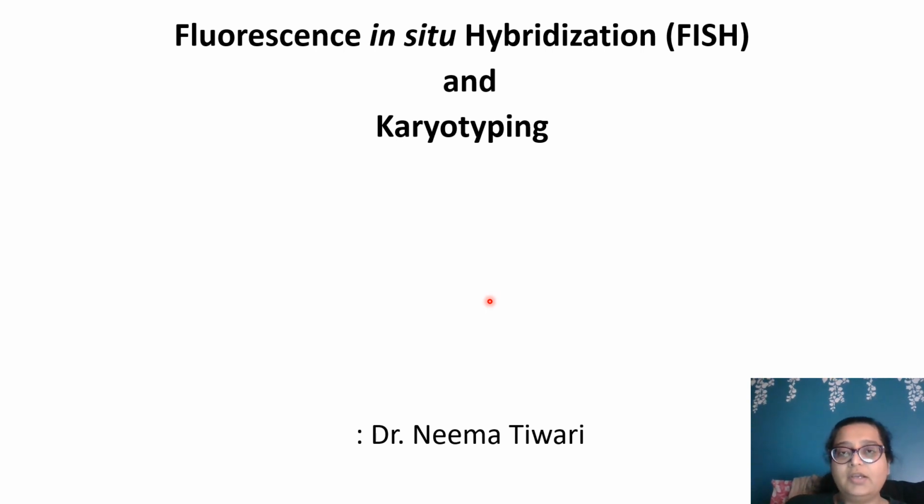I'll be starting with FISH, and FISH can be used in a lot of techniques. Mostly it's used in molecular diagnosis of blood cancers and some solid tumors like breast cancers. But similar techniques, keeping similar principles in mind, you will also study not under the heading of molecular, but under the heading of immunofluorescence. Immunofluorescence staining has a very similar principle, if not the same. Of course, there's no RT-PCR in immunofluorescence. There's no increase in copy number of the DNA, but there is antigen-antibody reaction and fluorescence involved. Here in FISH, there is no particular antigen-antibody reaction involved. However, there is the role of fluorescence in FISH also.